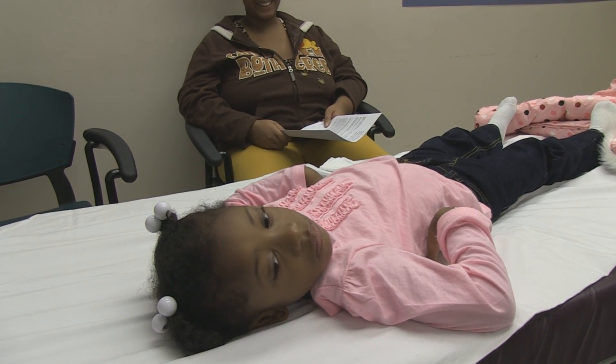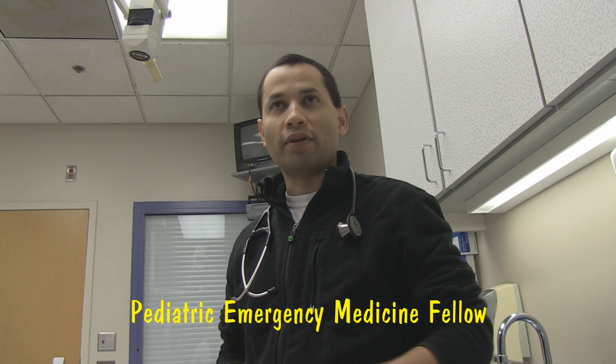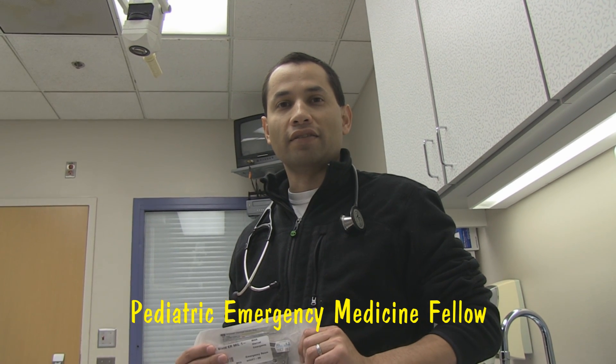Mom, you are okay with this video ending up on YouTube? Dr. Salivar, tell me a little bit about what you are going to try. We are going to use facial landmarks as a starting point for choosing the size of our laryngoscope blade. She would likely be a Miller 1 — maybe right, maybe wrong — so let's go ahead and try both.